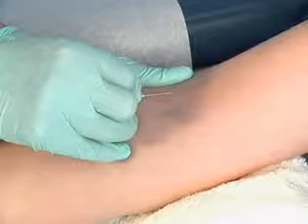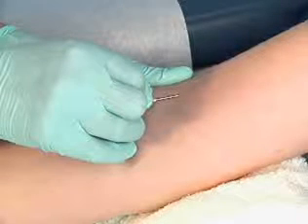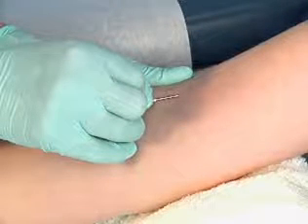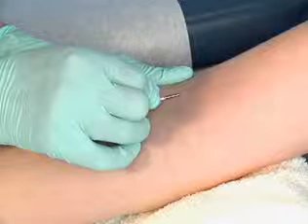Tell the patient that she will feel a small stick, using one continuous steady motion to enter the skin and then the vein. Using a continuous motion helps to reduce tissue damage. You will feel a sensation of resistance followed by a release as the vein is entered. After penetrating the vein, decrease the angle of the needle to 5 degrees.